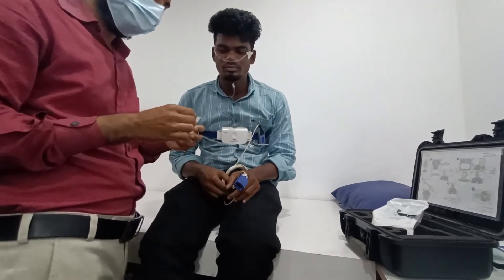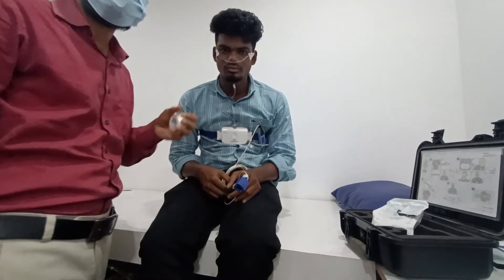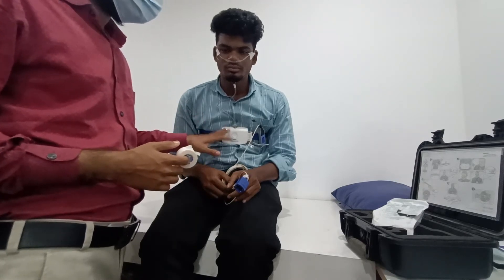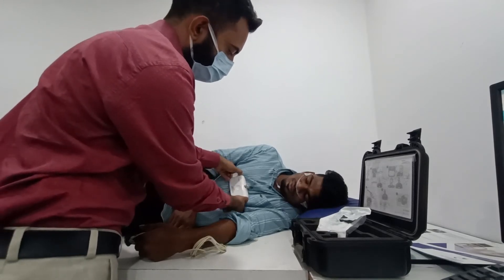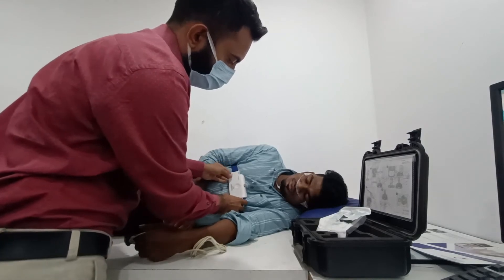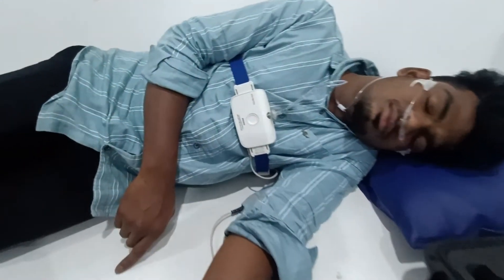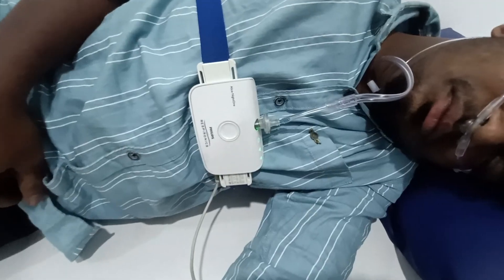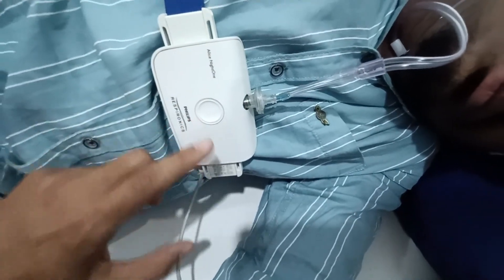Secure the nasal cannula so that it doesn't come out in the night. That's all — installation completed. To check whether you have put the machine correctly, you will see all three lights come on. When all three lights come on, that means the connection is secure. Installation completed.